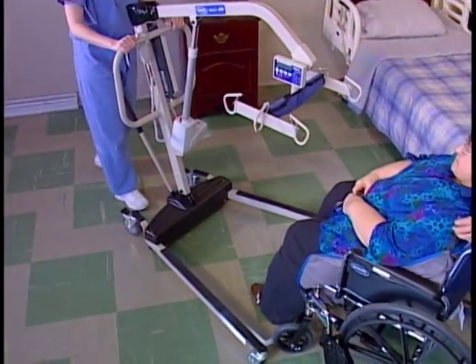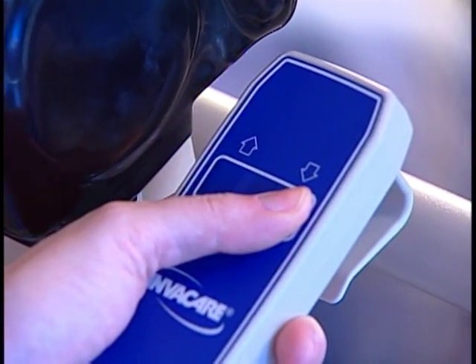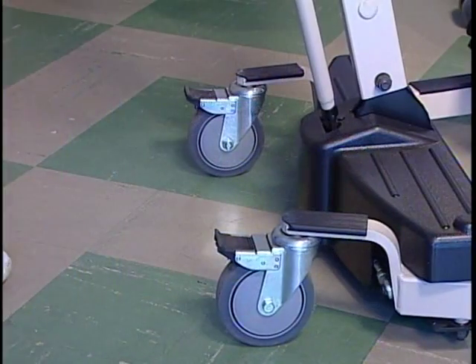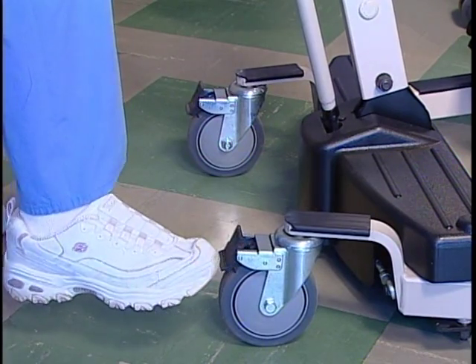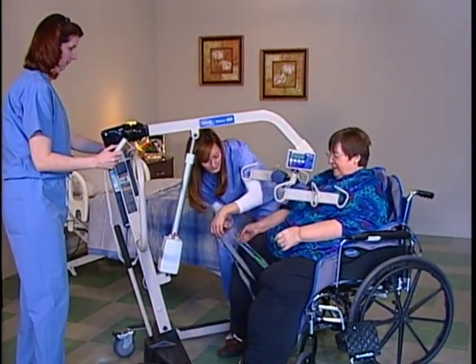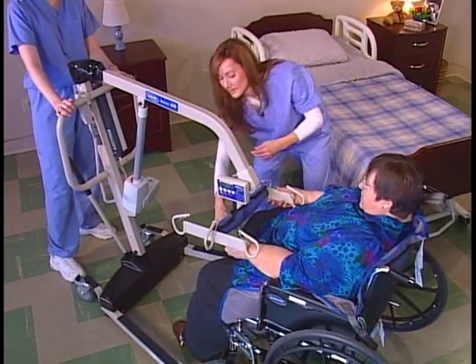Position the lift so it's over the wheelchair. Lower the boom so you can attach the sling to the swivel bar. Lock the rear casters to secure the lift. Position the swivel bar so that it's parallel with the resident's shoulders for proper attachment, then attach the sling.